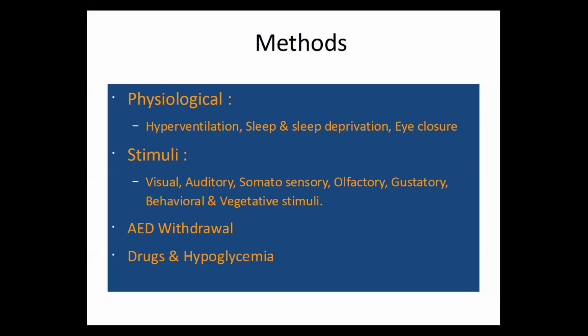So hyperventilation, sleep. Occurrence of sleep as well as sleep deprivation, both are activation procedures, as well as eye closure.